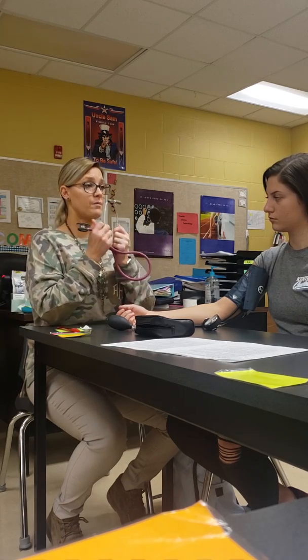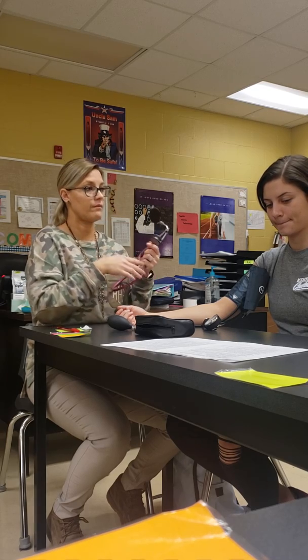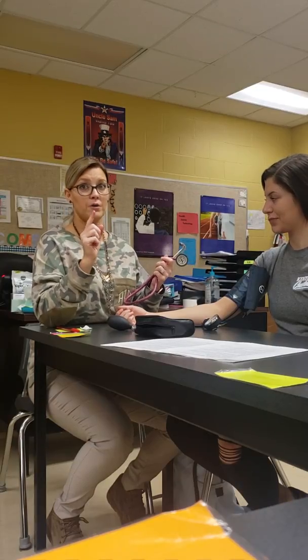All right, so I've cleaned the earpieces and I've cleaned the diaphragm. Locate the brachial artery at the inner aspect of the elbow. Typically you are not going to feel the brachial artery because it is deep, but I'm putting my fingers there so that I can say that I know where the brachial artery is.